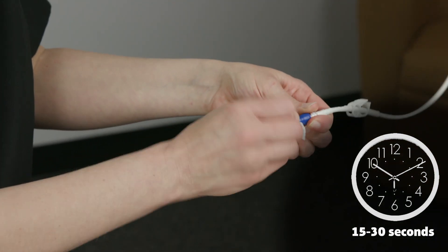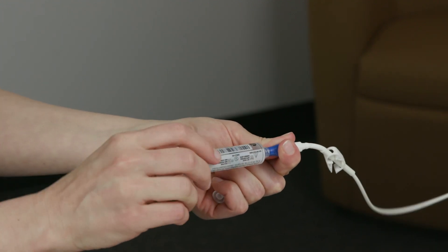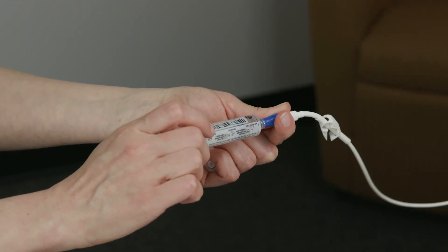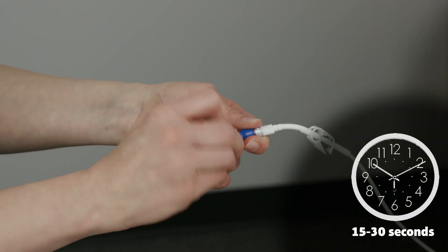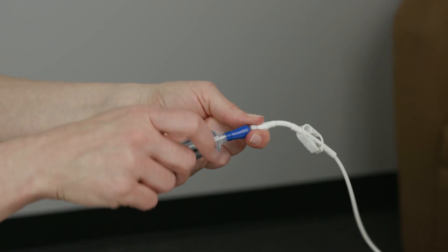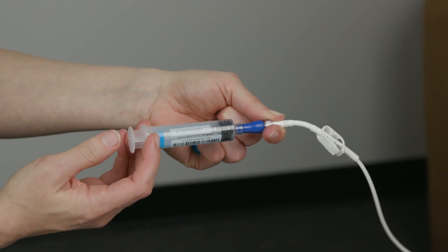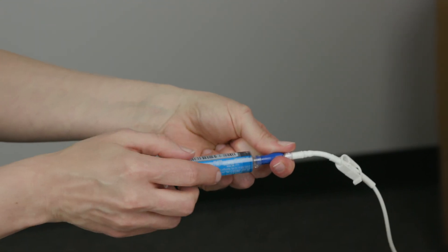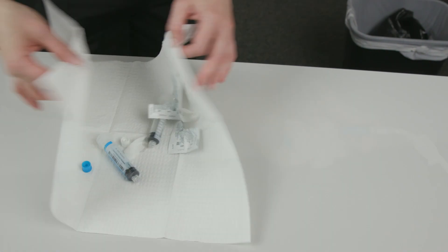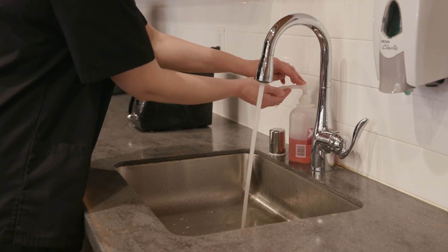Scrub the hub of the IV catheter, then flush with a pre-filled saline flush syringe following the same steps you used before the infusion. Scrub the hub of the IV catheter, then flush using a pre-filled heparin flush syringe. Close the clamp on the IV catheter, then remove the heparin flush syringe. Put all of the used supplies into the trash. Clean your hands with soap and water or alcohol-based hand gel.